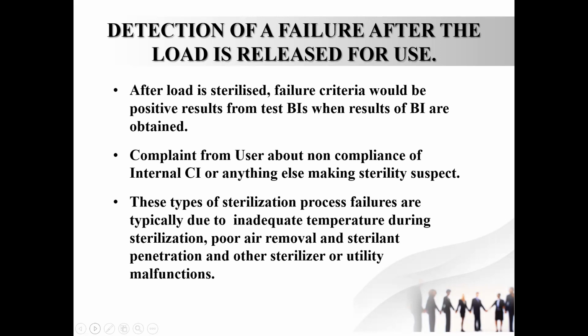The second reason after release is that the user may complain that there was one chemical indicator internally. When they opened the pack, they found that it had not passed. So these are the instances when you detect the failure after the load has gone to the wards or OT or any other user department.